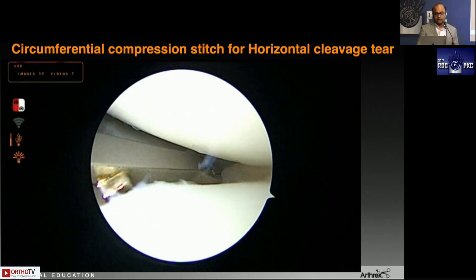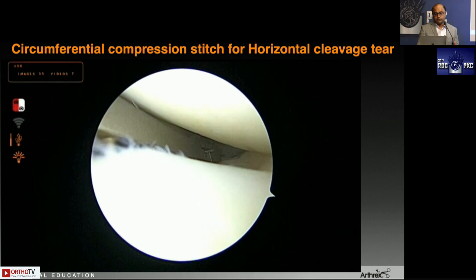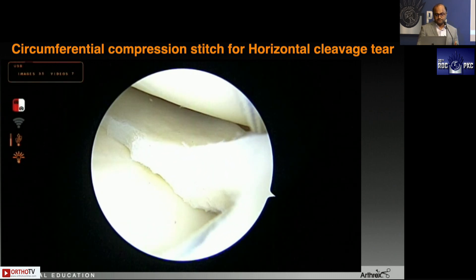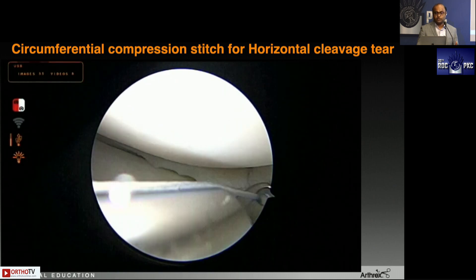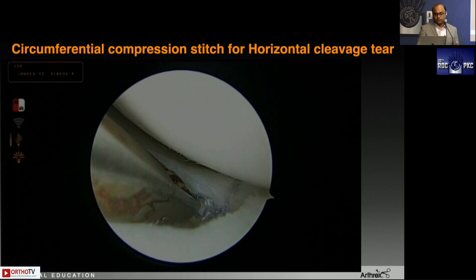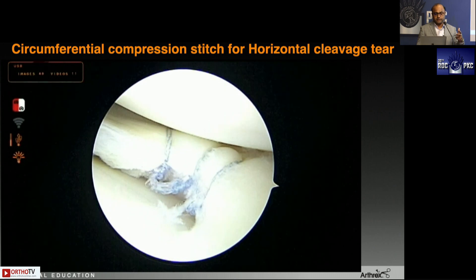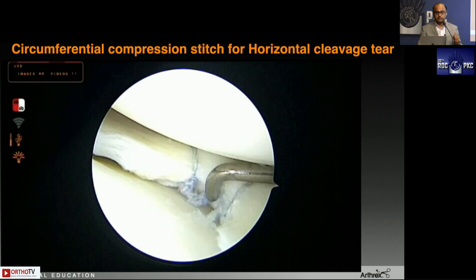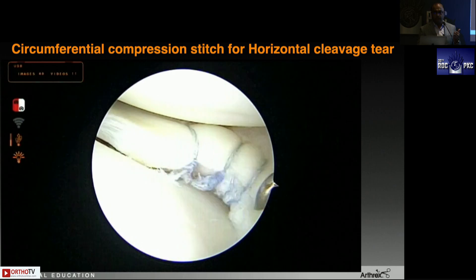Circumferential compression stitches, also called hay-bale stitches, are used for a horizontal cleavage tear. For the lateral meniscus, visualization from the anterolateral portal, instrument coming from the anteromedial portal — turn the device away from the cartilage circumferentially, taking the bite through the entire meniscus. Keep the post on the inferior stitch so the knot goes on the under surface, then tie a knot. You can also do it sequentially: take the bite through the inferior leaf, load the suture again, take the bite through the superior leaf, and tie a knot.